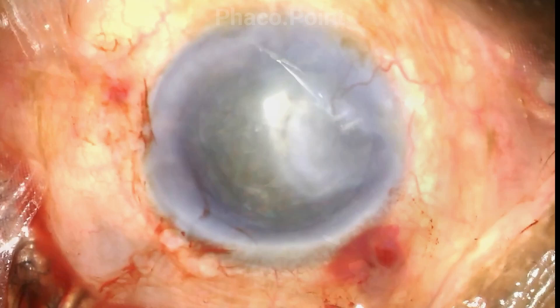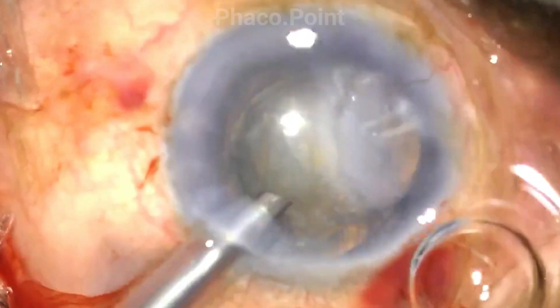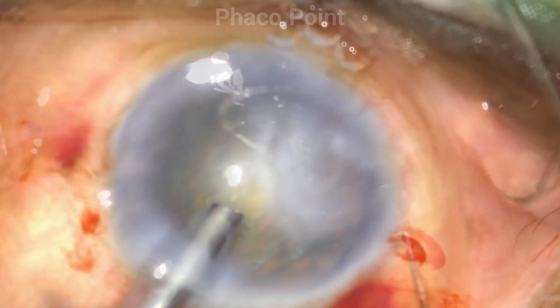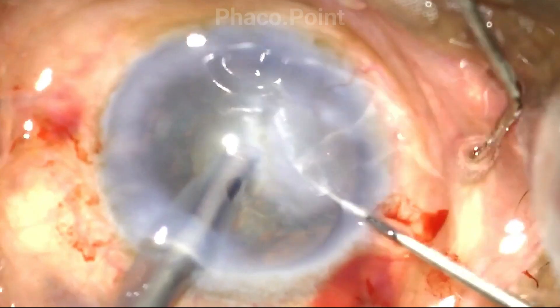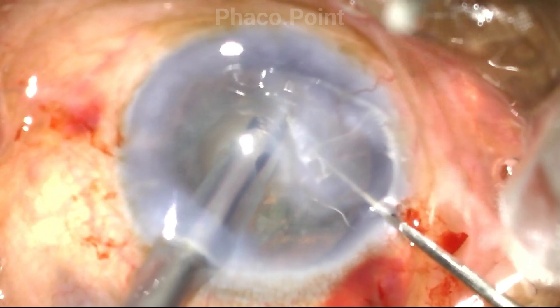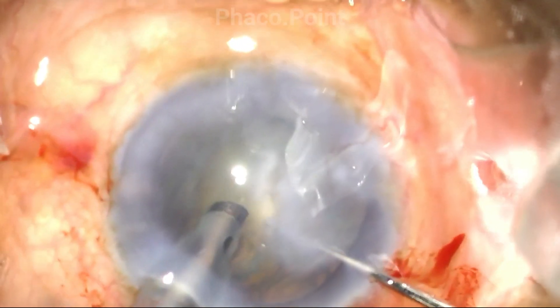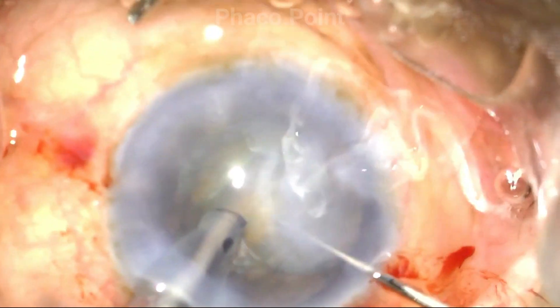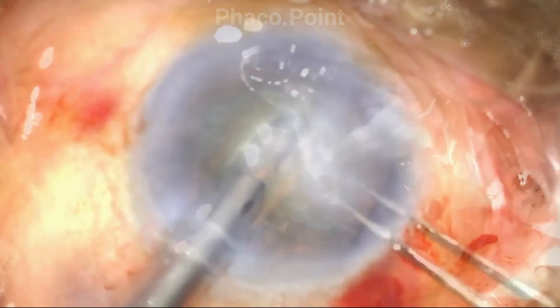We now proceed with nucleus management, working under low flow settings — I tend to reduce the flow rate a bit to give added control. Normally I would perform a direct chop, but here I would probably be unable to see the direct chop happening, so I choose to perform a stop and chop instead.